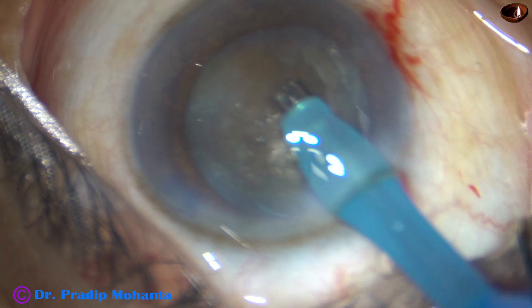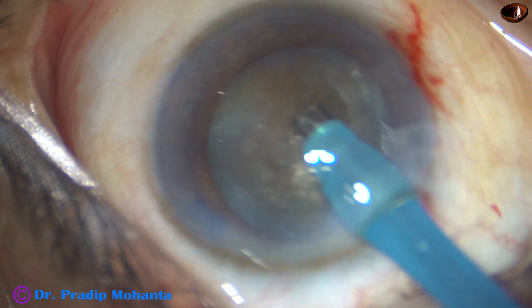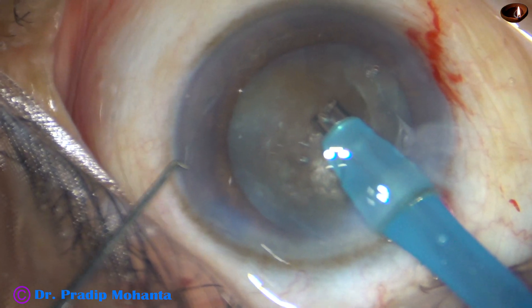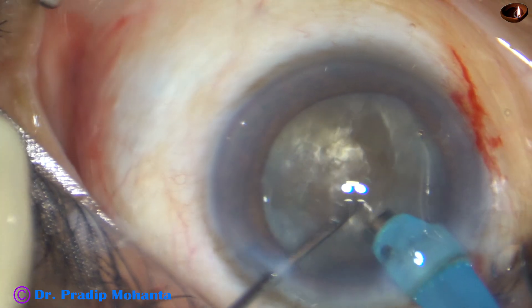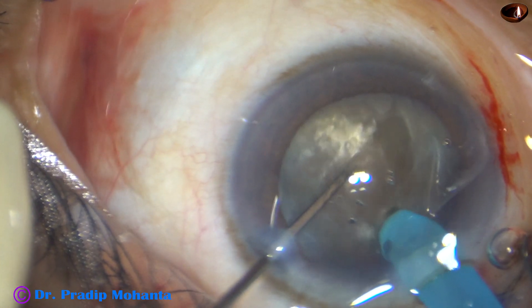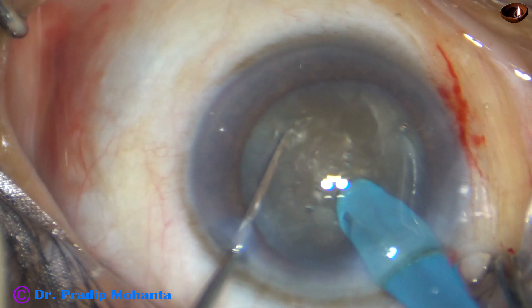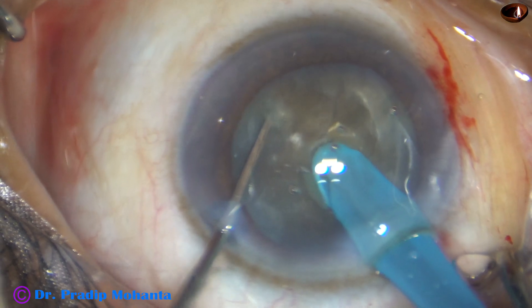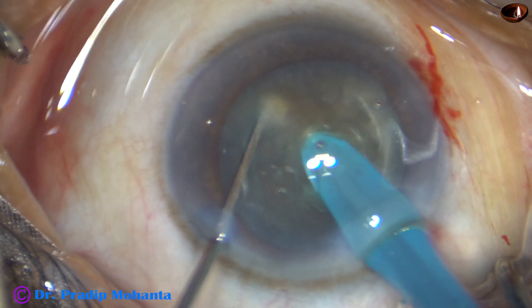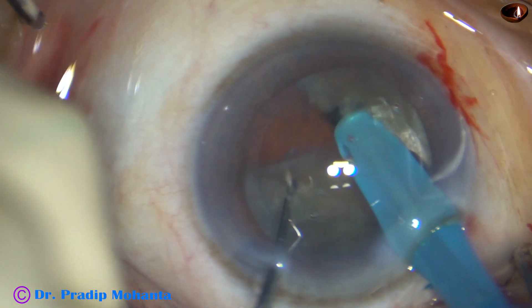The exposed part of the phaco needle — the tip — is buried completely into the substance of the nucleus. It goes through the nucleus like a submarine moves through water. It is buried into the substance of the nucleus, goes through it, crosses the central part, goes for some more distance. And as it reaches near the opposite equator, it is chopped.